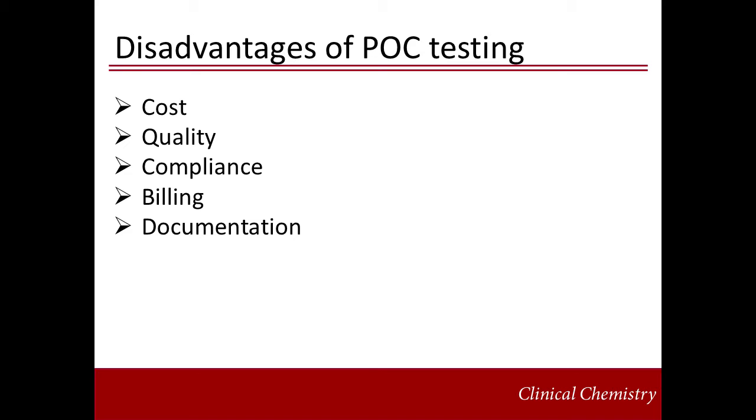facets overlooked. For example, capillary specimens are often used for certain POC tests, such as hemoglobin. Depending on the skills of the person collecting the capillary sample, the imprecision of the measurement can vary greatly. In addition, even if performed correctly, some POC devices may not be as precise, accurate, and/or as analytically sensitive as their automated laboratory counterparts.